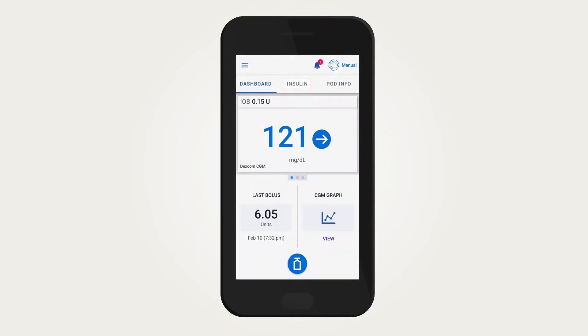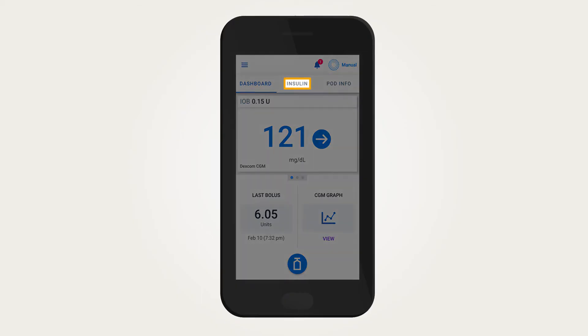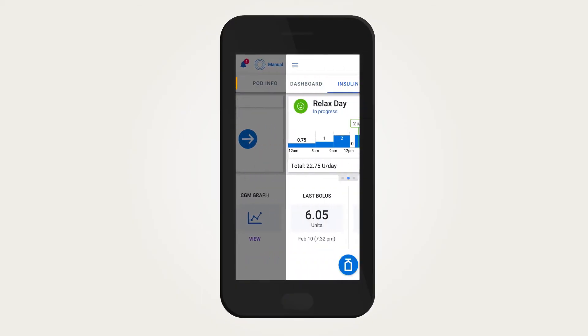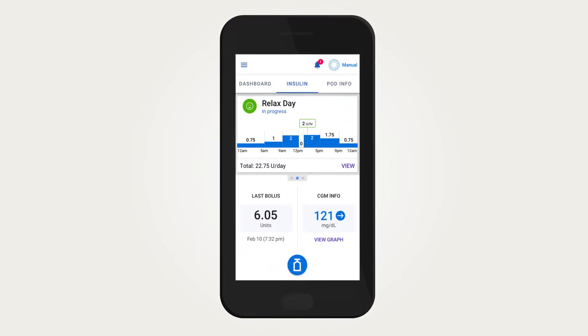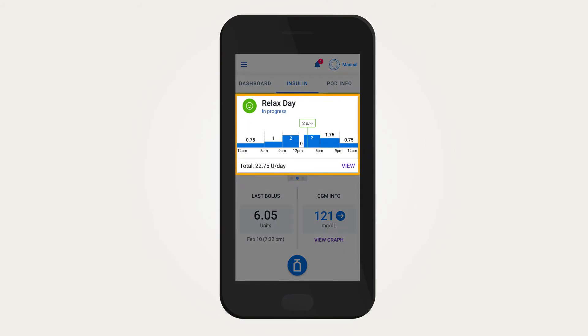The insulin tab on the home screen will allow you to access additional details about your manual mode basal delivery.